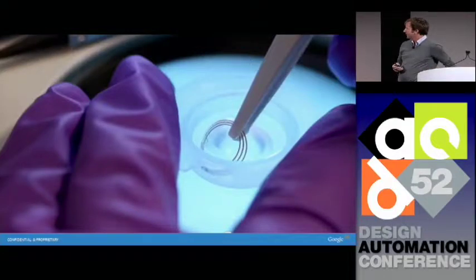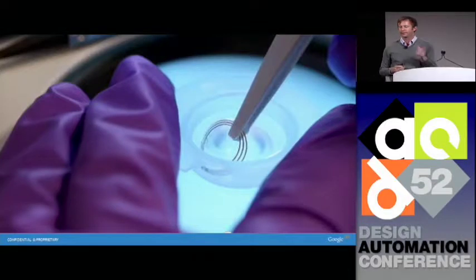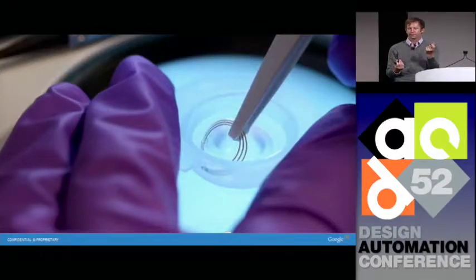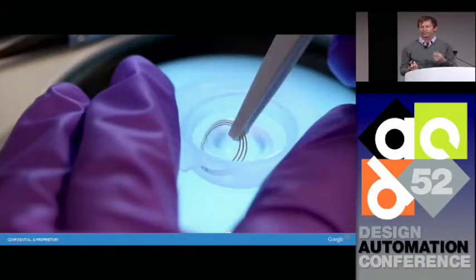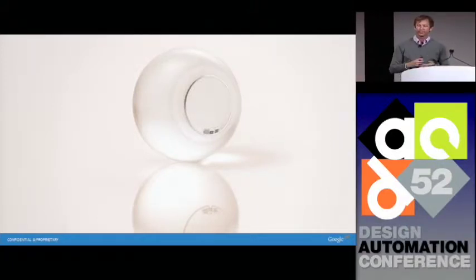This is an image of one of our scientists pulling a prototype device out of the mold. Hopefully you can intuitively get a feel for what this device looks and feels like. It looks and feels like a standard soft contact lens. This is what one of our latest devices looks like. It looks a little bit different than the earlier devices.